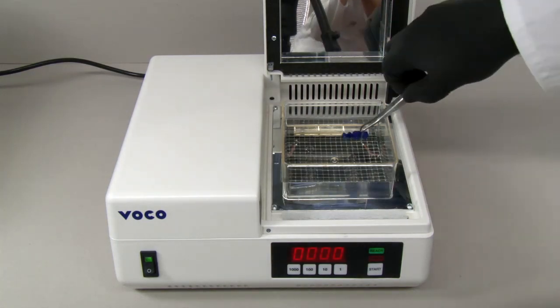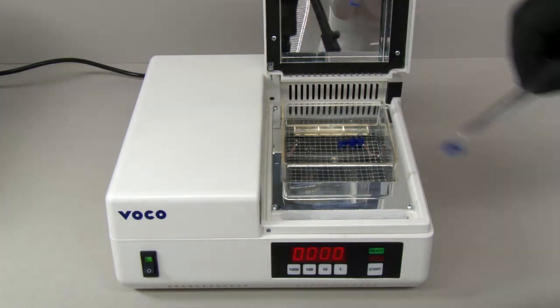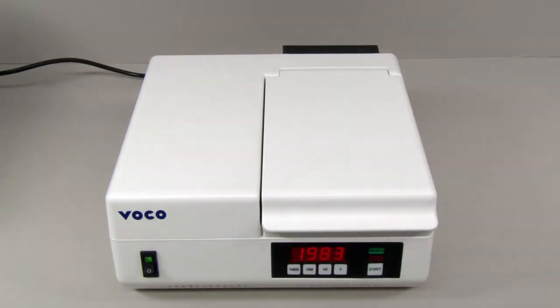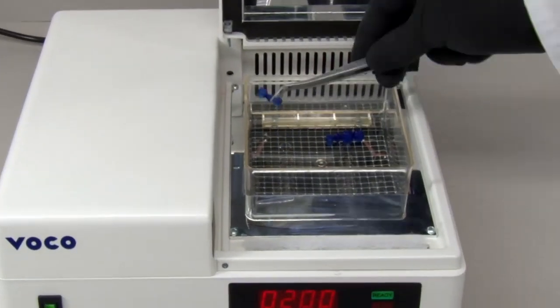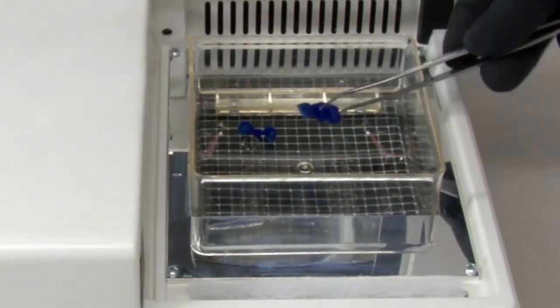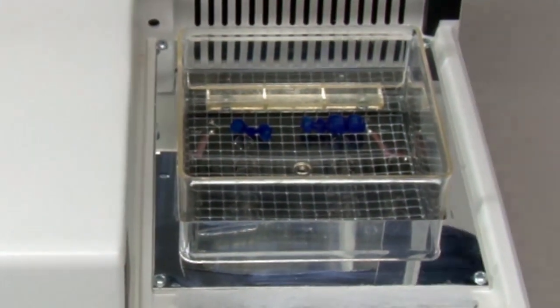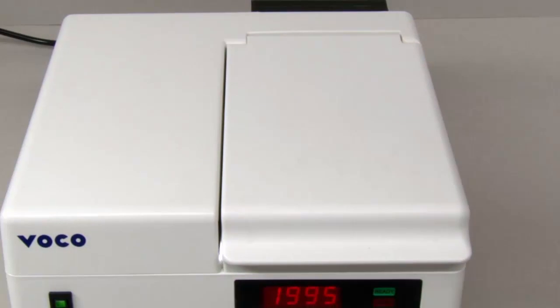and then the post-exposure takes place. Post-exposure without supports, because these can throw shadows and hinder complete post-curing. We give here 2 times 2000 flashes. Before the second run, let the restorations cool down for 2 minutes. Turn once, close the lid again, and expose again with 2000 flashes.